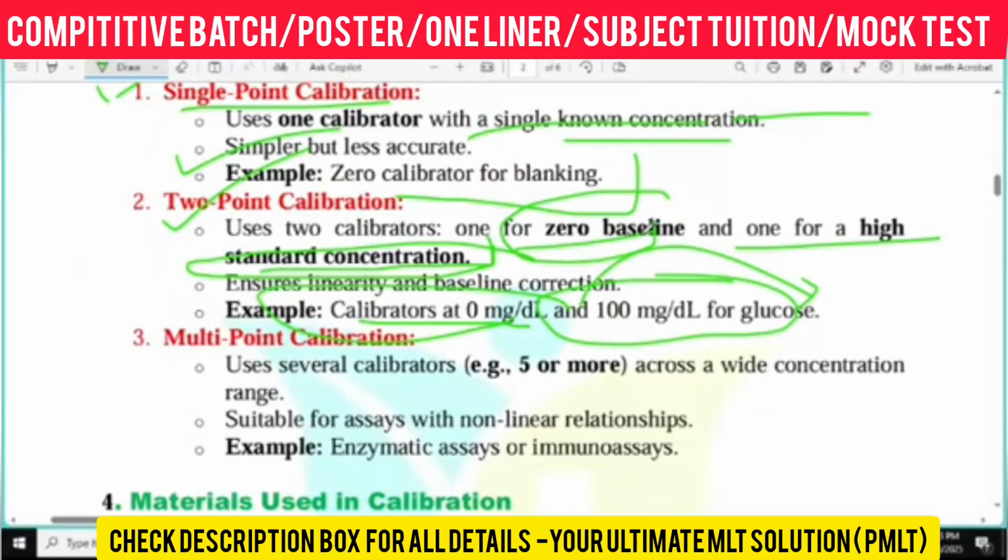We are using zero for the zero baseline, as well as the high standard concentration. Zero concentration is for the zero baseline and 100 concentration is for the high standard concentration. Getting my point? That is two-point calibration. Understood? Two-point. And next I am explaining the multi-point, then you will say.